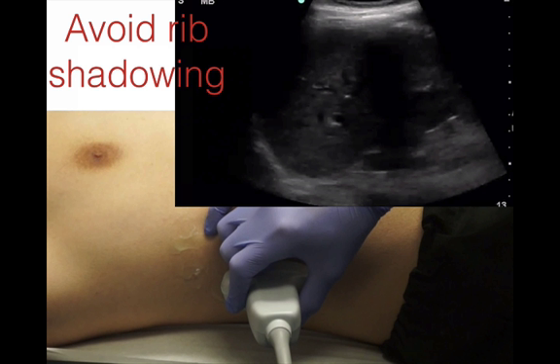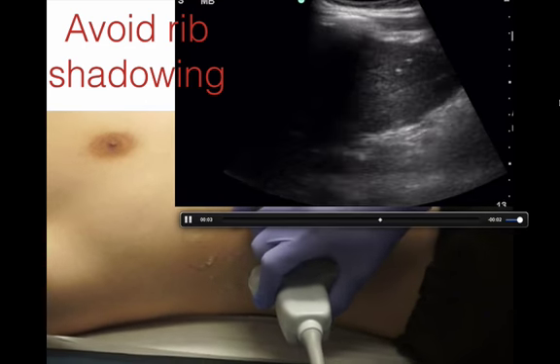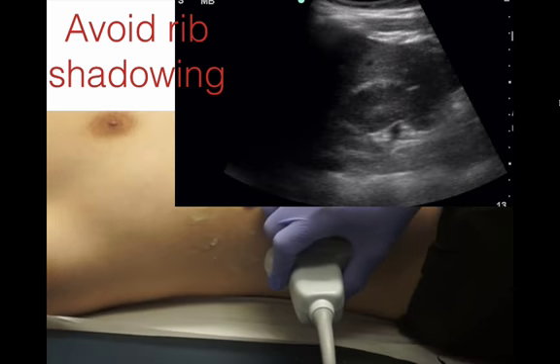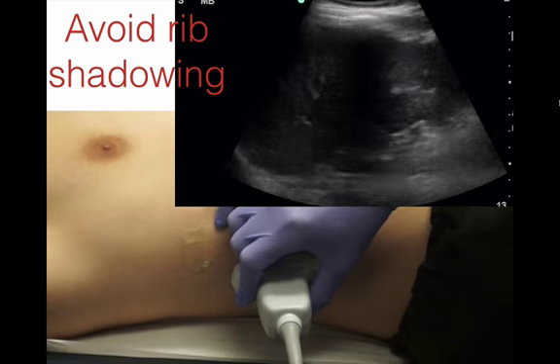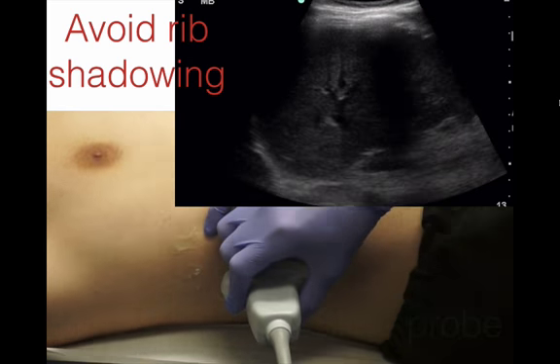So one of the first things that you'll encounter in the FAST exam is rib shadowing. And again, rib shadowing looks like this. You have bright white and a hypoechoic or anechoic region that is just deep to the rib. And how you get rid of that is you just slide the probe either inferiorly or superiorly so that you are in an intercostal space above or below that rib. So it's just nice and easy, inferior, superior sliding.